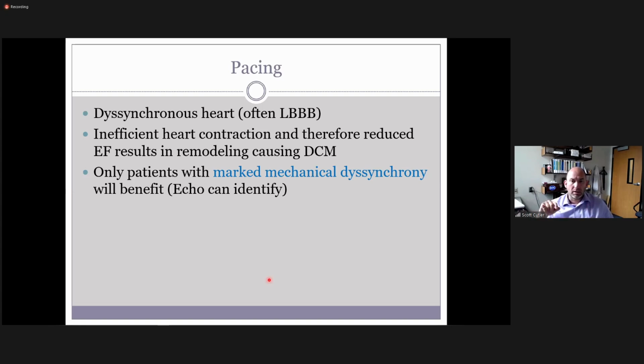They would put the wand over the chest and often disable the pacemaker initially to see what the native rhythm is. We're sitting in the room scanning the patient, and instantly, as they change that, they go back to this weird abnormal rhythm. The patients become very symptomatic quite often, immediately. And you notice that change right away. We're seeing it in the E and A wave, and also in the timing of the wall contraction. Then they tweak their settings, make a few adjustments and activate it, and all of a sudden the patient is back to normal. It's the weirdest thing, watching this patient in real time go from very symptomatic to normal, and what we do is try to bring it to the most normal pattern.